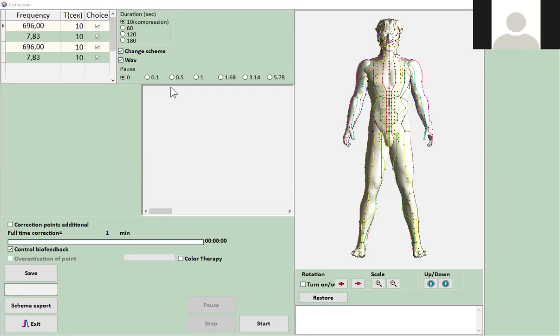And how long does the recording on that last? In other words, I've noticed in some of the instructions, it says have the person wear it for a number of days, for a number of hours. Basically, right now, this is the one that was made. Before it was 2 stripes, you had to reload them and do different stuff. Now you can download frequency. It doesn't go anywhere. The frequency is the same. You can have the band of these magnetic stripes up to 3 centimeters here, and charge them. Then you put them into this foil, so it will protect them so they won't recharge themselves. And basically the patient can wear it 5 hours a day, every day.